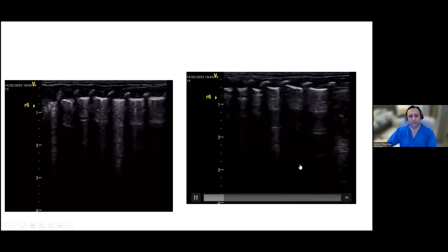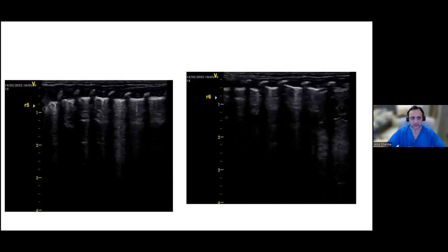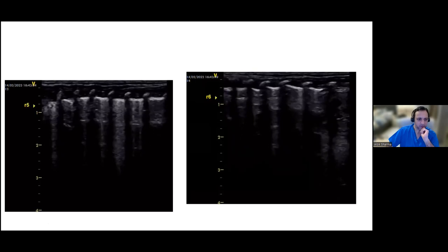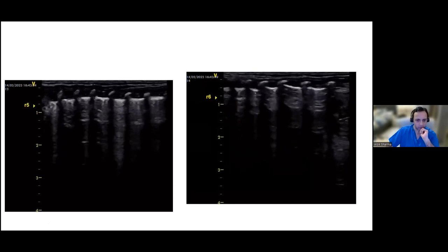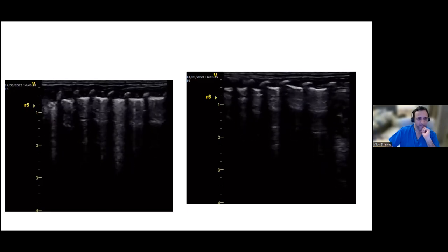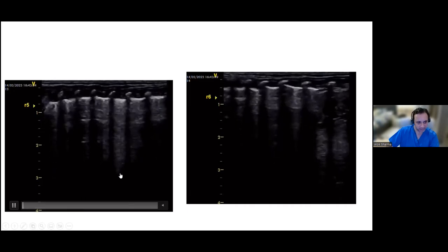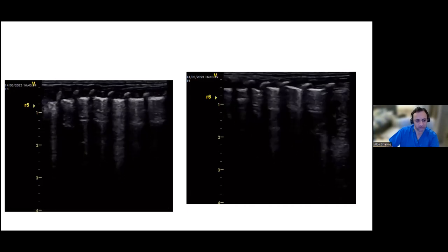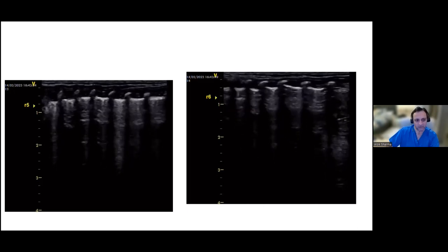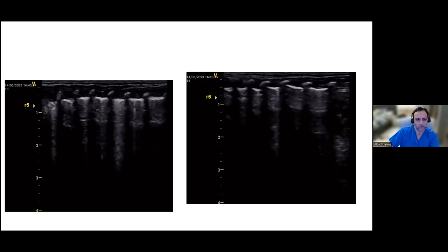So the main critique for me from the previous images: A, your gain settings are on the lower side and need to go up, because my gut feeling is that in this image, if you had higher gain settings, your depth penetration would have been good. I can see B lines virtually all the way down up till 3 centimeters, and then it becomes very dark. So we just need to push your gain settings up. And when you push the gain settings up, if you feel you're having dropout in the region beyond, it's kind of just dropping the frequency a little bit to get a little bit better depth penetration, and or taking your focus down to about that 3 centimeter area to get a feel for what you're seeing over there.